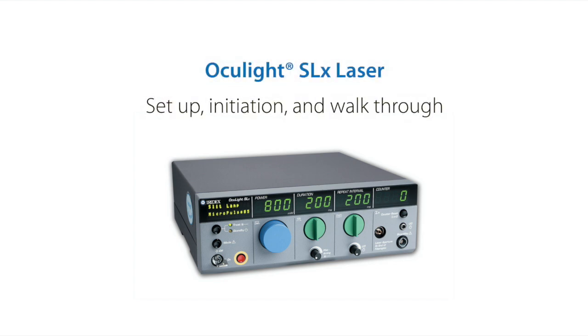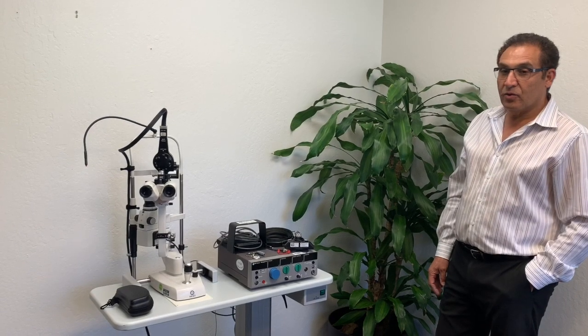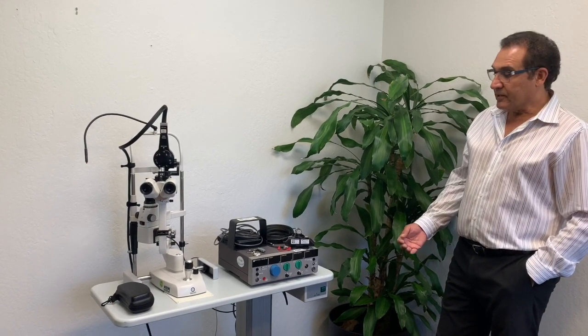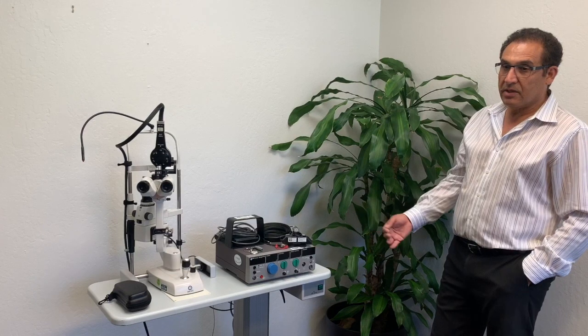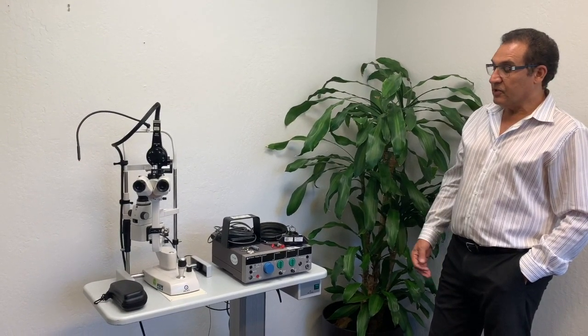The purpose of this video clip is to set up an Occulight SLX for proper operations. I will go through the sequences to show how the system is set up, prepared and ready for the physician's use.